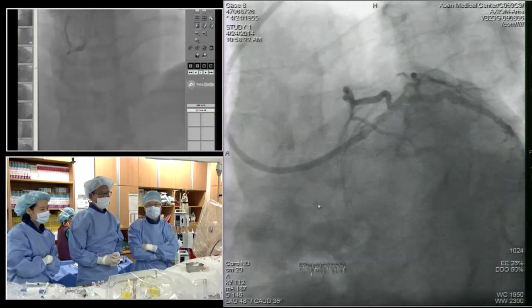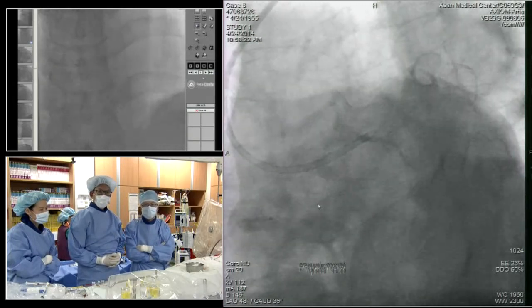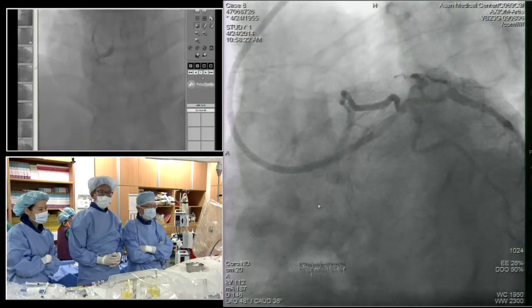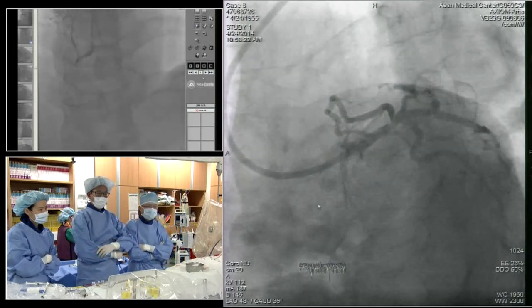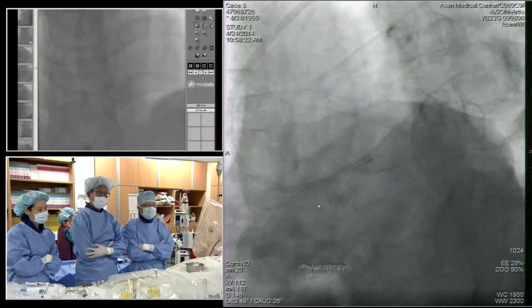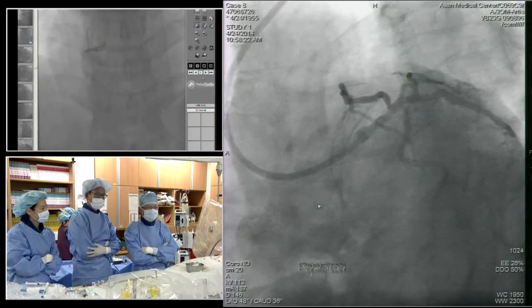So the first CTA test, in the US, probably most insurance companies would not let you do that. Yeah, I think that's the point. He never would have gotten a CTA in the United States. He presents as somebody who's got reasonably high pretest probability due to risk factors, but he's asymptomatic. Right. And, for a checkup. Right. So I don't think anybody would have done anything in the U.S. Right. Probably lower cholesterol, stop smoking. They would have missed this.